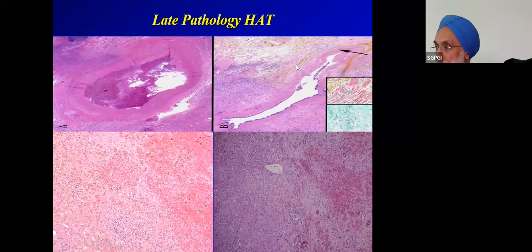Bile is a foreign substance which excites an intense chemical reaction. So that can cause necrosis in the surrounding area. The necrosis may undergo superinfection. This actually is Candida growing in this necrotic bile duct. You can get areas of periportal hemorrhage, and you can get areas of frank infarction. So that's the spectrum of changes in hepatic artery thrombosis.